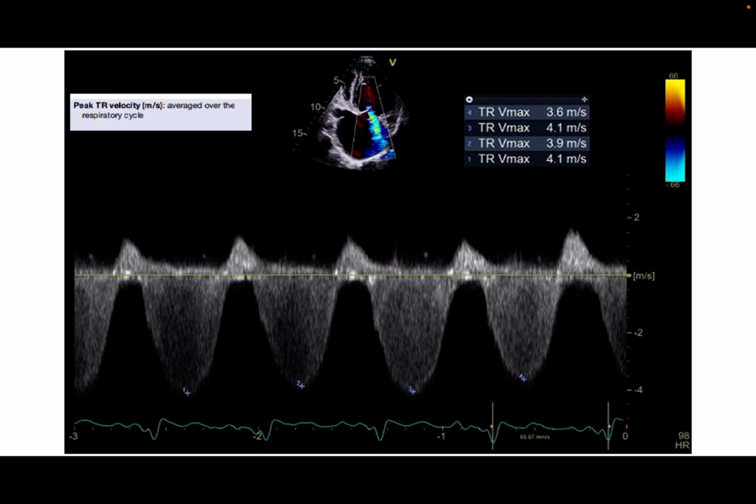Clinical distinction: in group 1 pulmonary hypertension, E prime is often preserved, with normal relaxation, E to E prime may be low normal, and LARS is relatively preserved. In group 2 pulmonary hypertension, with elevated left atrial pressure, E prime is reduced, E to E prime is elevated, and LARS is reduced. This is the echo differential for pulmonary hypertension classification.